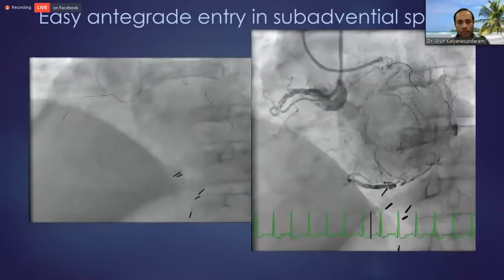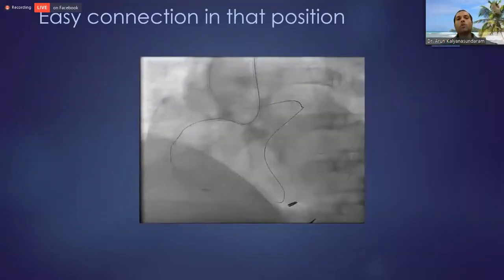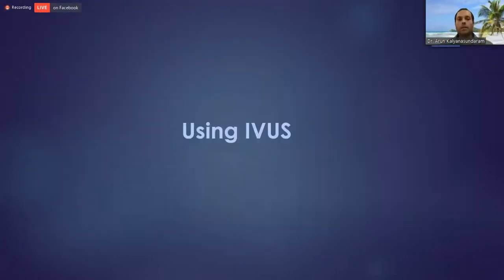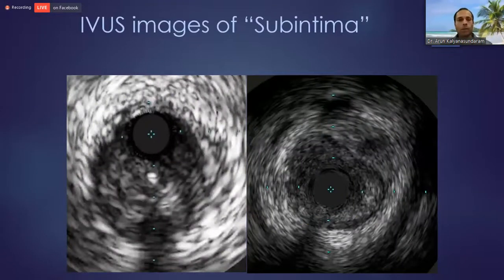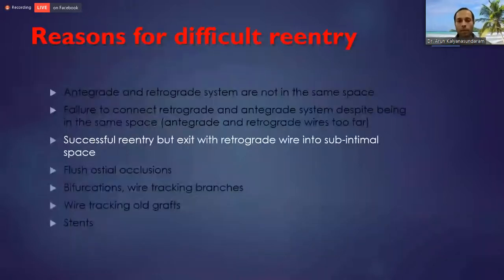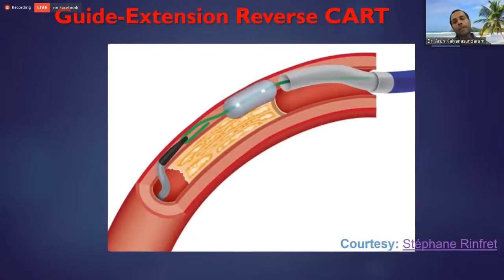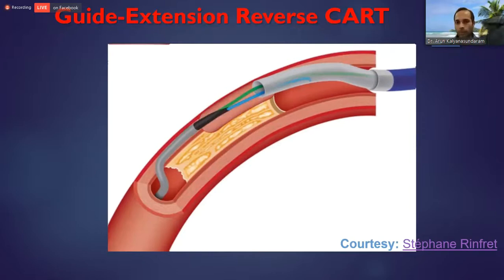Again, in the interest of time, I'm just going to skip all this, but the idea is don't get wedded to 'I'm going to do reentry right here.' Use IVUS to understand where the various things are. There's no substitute for this, so you've got to understand imaging pretty well. And the one other thing, unless it's truly ostial, use guide extension reverse cart because it makes life a lot simpler. Sometimes you might make the connection, but then again go subintimal. So that takes care of that problem.